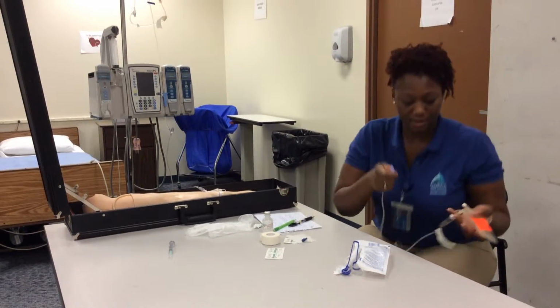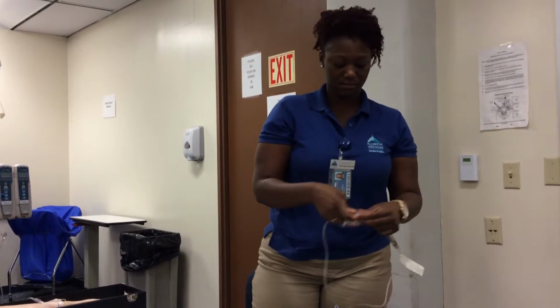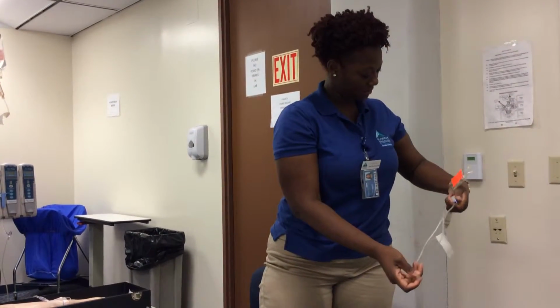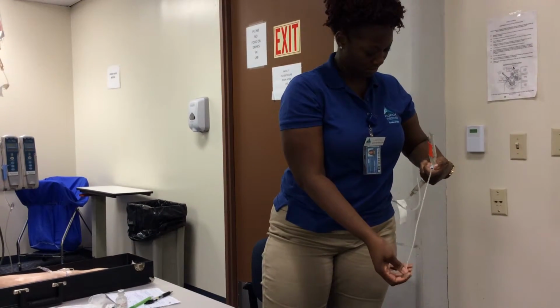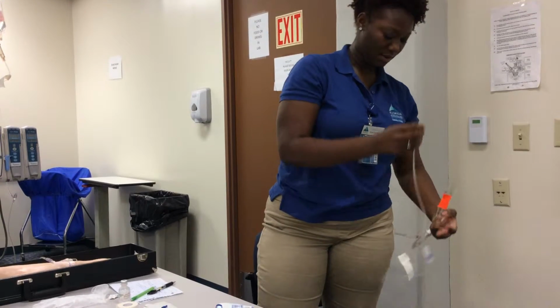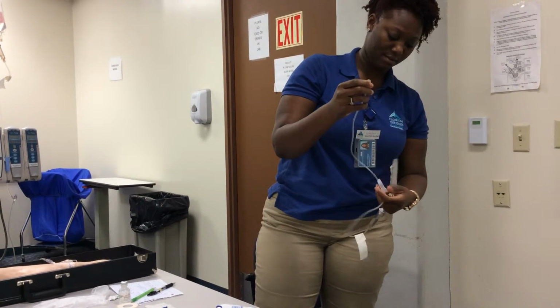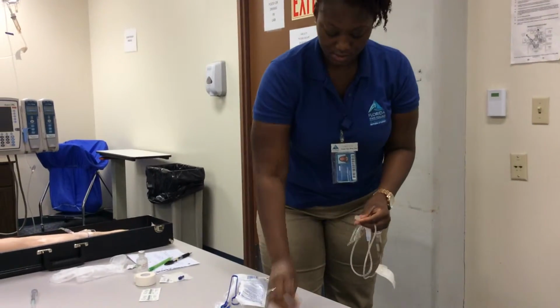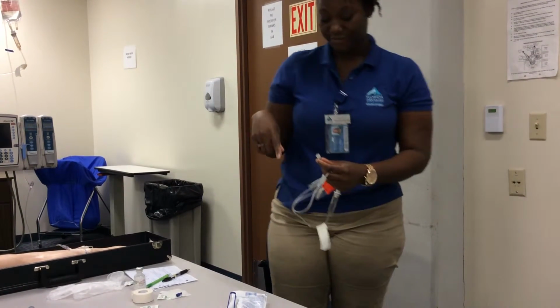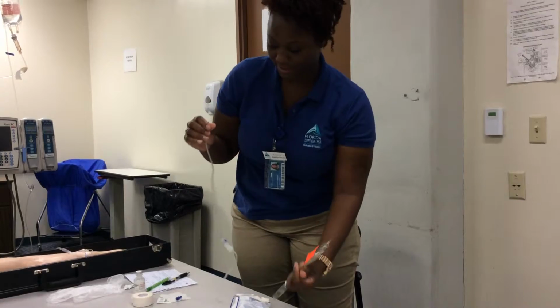Let me go ahead and prepare my line. Good. Alrighty, so mine is ready. Close this back off, and if that didn't fall, I will place it back on the top and it will be sterile.